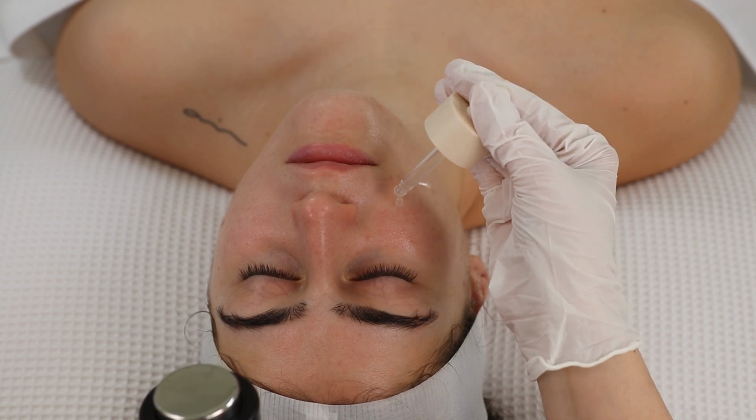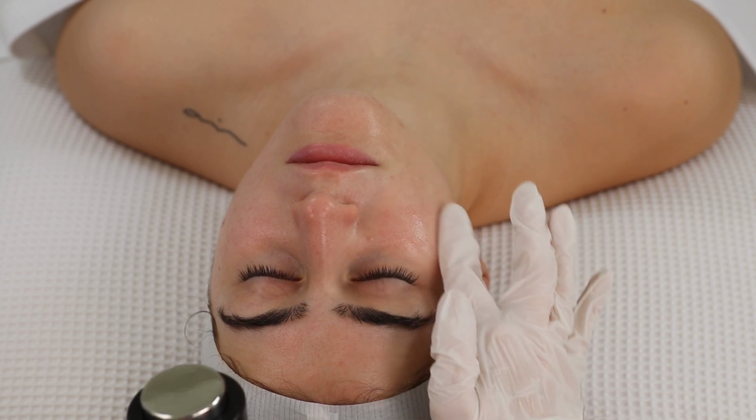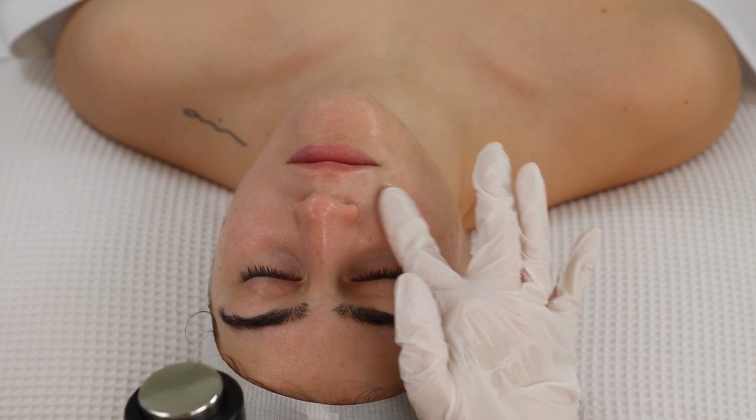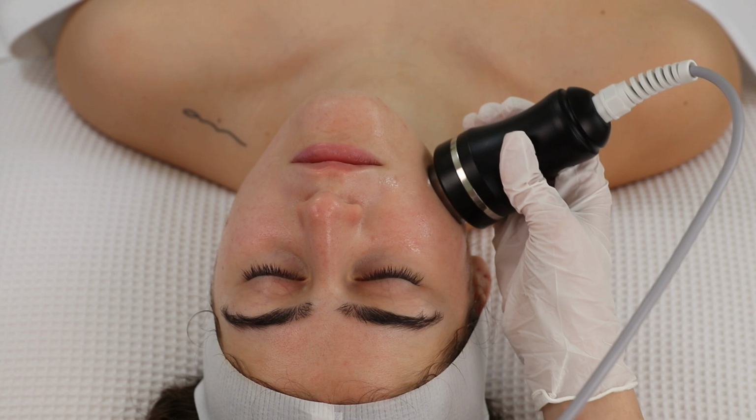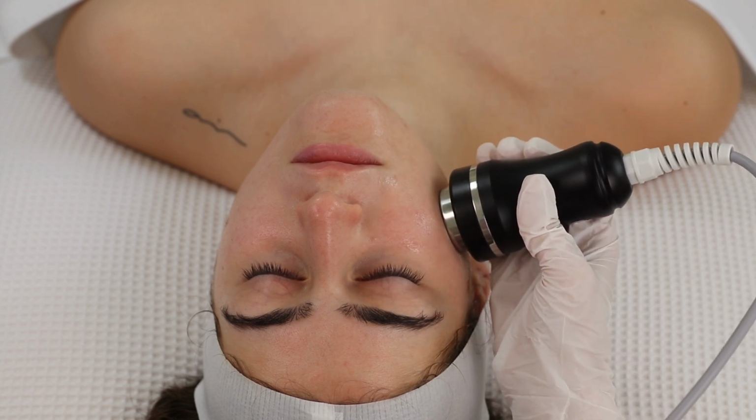Apply 3 drops of the serum onto the right side of the face and spread it across only using one finger. Place the probe on the skin and use slow circular movement, starting from the chin area, moving up towards the jawline.